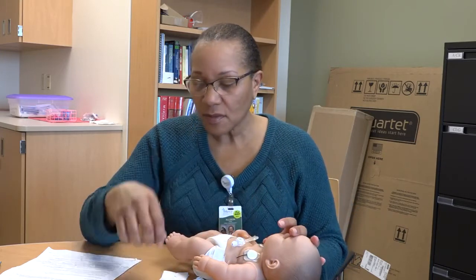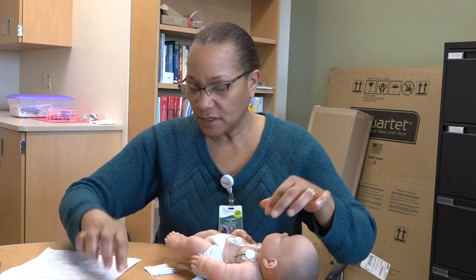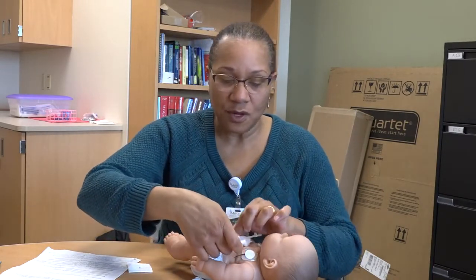So let me blow the retention balloon back up so that you can see what the split 2x2 looks like. This is the dressing you'll have when you go home.